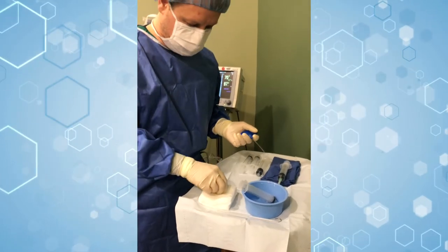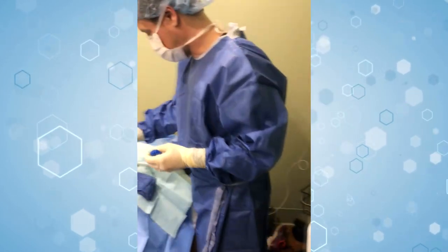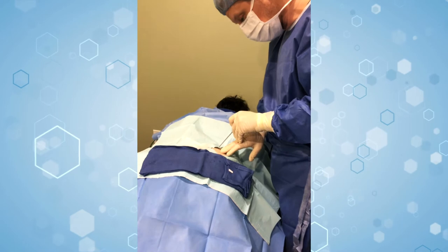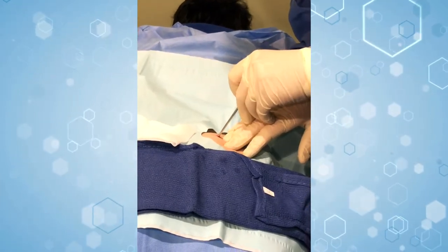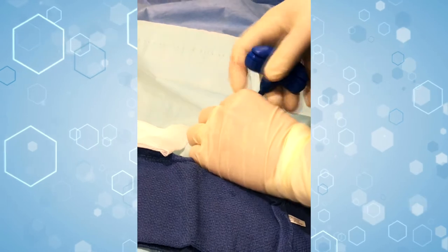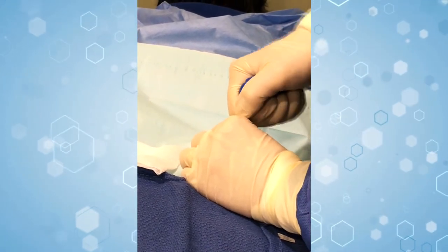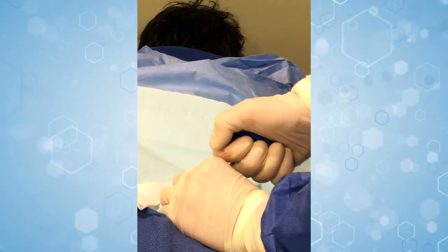Now this is the part that most people are scared of — actually going into the bone itself. So I'll show you how that works and how it's not as bad as everyone thinks. We're just going to go in gently right here, go down until we touch the bone. We've made contact now, and we just hold it nice and steady and do a nice steady rocking motion. Almost through.